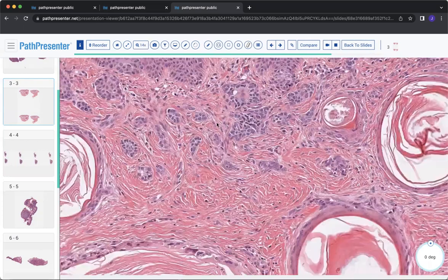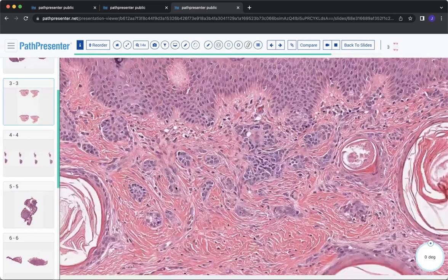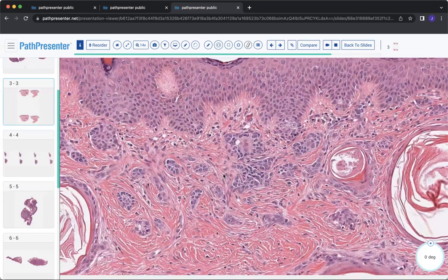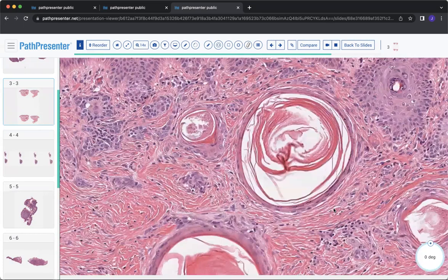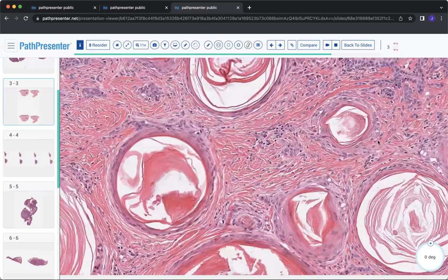From this power, you might even be debating, are these nevi cells or are they basaloid islands? So you could do a SOX10 or keratin to make sure that you're dealing with a keratin-derived or a keratinocyte-derived population as opposed to a melanocyte-derived population. But these are clearly keratin-derived cysts or milia-like cysts.